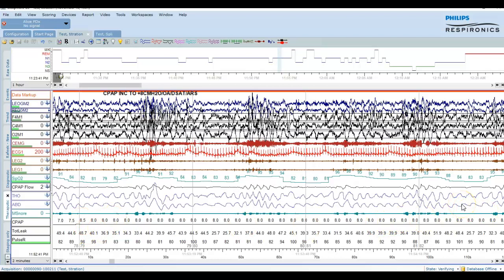Let's observe again for a minimum of 5 minutes. That's not the maximum time. I repeat, 5 minutes is not the maximum time. You don't have to increase every 5 minutes. You can wait for a few more minutes, especially if you're a newbie. Wait for 10 to 15 minutes, then you will get a clear picture of what is happening to the patient.